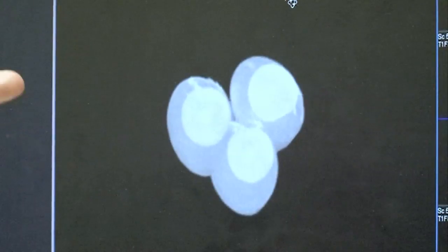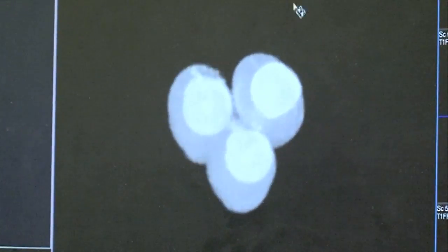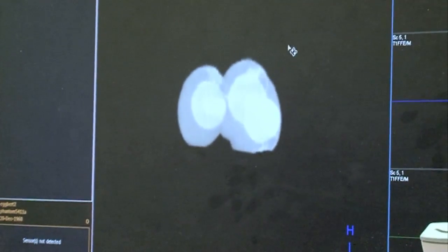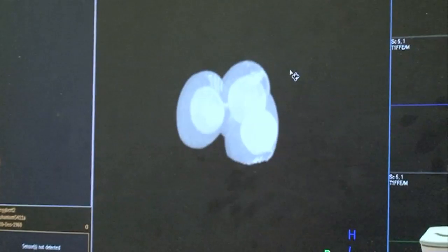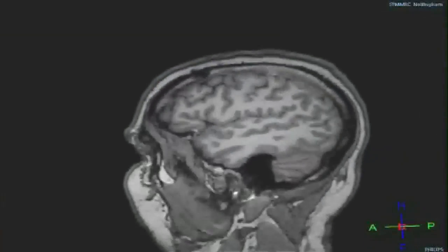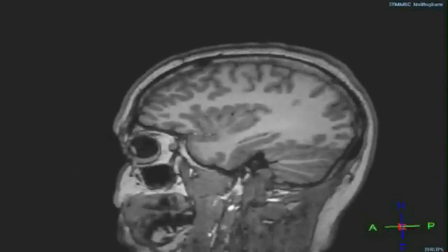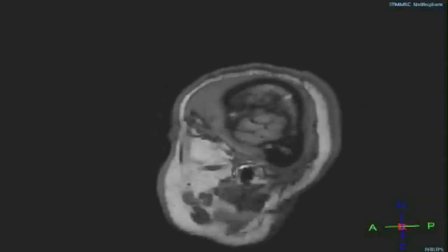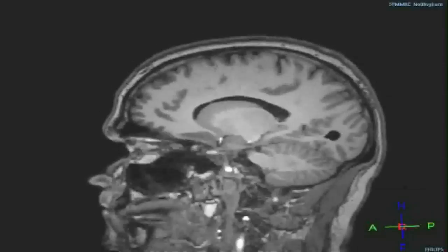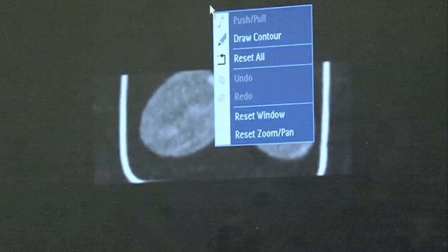The images we acquired are three-dimensional — they have lots of slices scanning through, which allows you to see the three-dimensional structure. That's obviously much more useful if you're looking at brain images and you want to understand the relationship of different regions of the brain to one another, or if you're a surgeon planning an operation and you want to find the best path to get to a particular area in the brain. This kind of 3D view can be very useful.